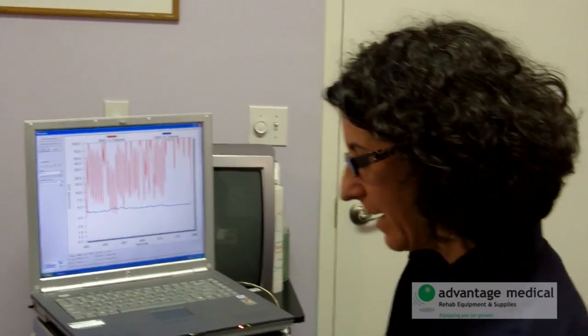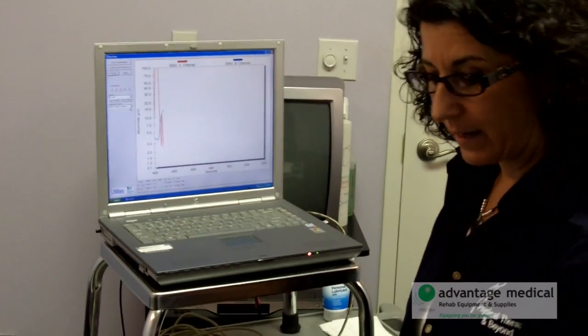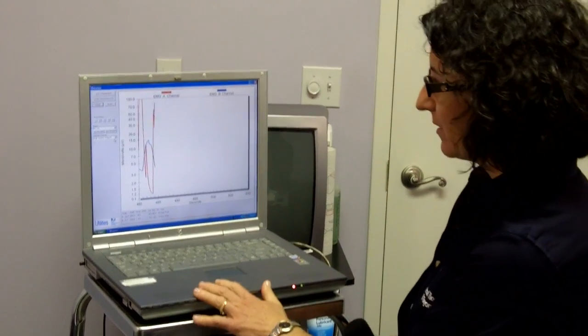Hey Joan, you got everything all set up there? I know it's not the most comfortable thing, but you're going to be leaning back on the table and you're not going to be moving around a lot once we start this. So I'm going to take your piece of the probe there — the wire — and I'm going to connect it right into the biofeedback.